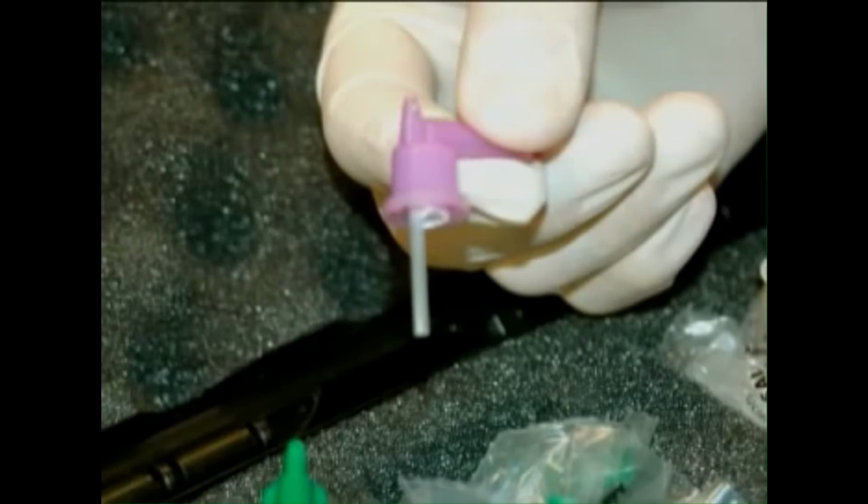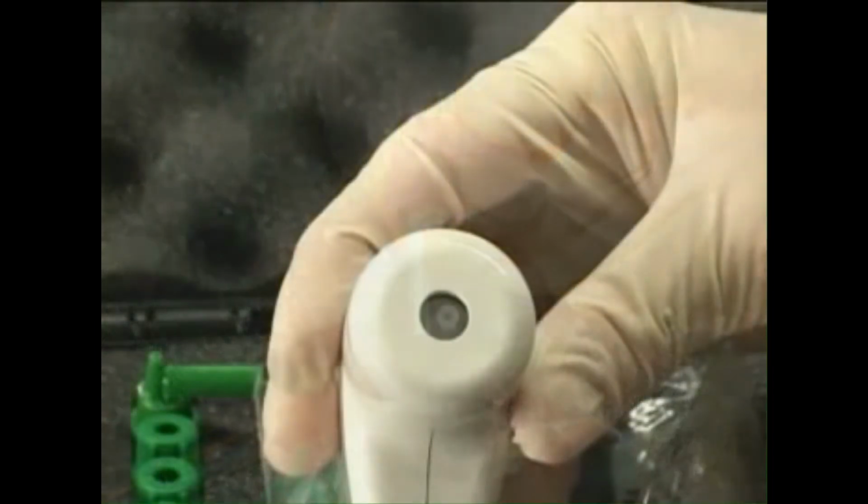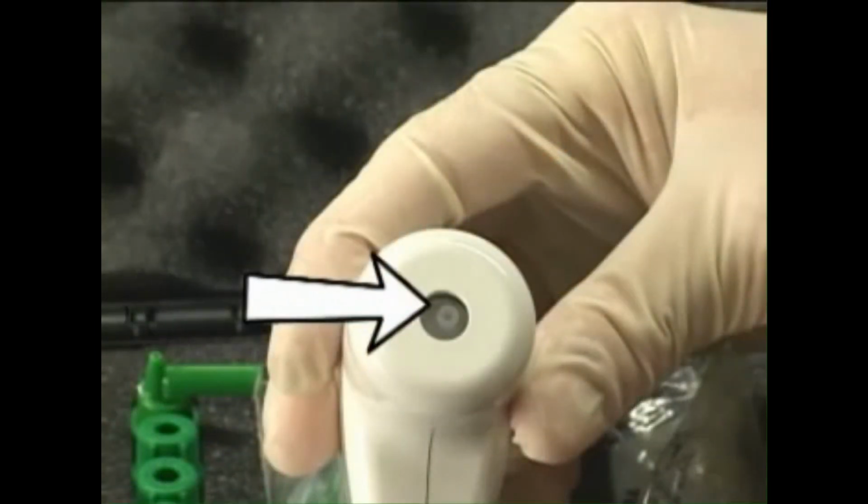The adapter contains a capillary straw that is internally coated with anticoagulant to allow the blood sample to come into immediate contact with the anticoagulant, eliminating one of the major causes of clotting. This is especially helpful with slow bleeders. The quick draw adapter also contains a primary vent filter that prevents blood and airborne particles from escaping the collection vial. A secondary hydrophobic disc filter is in place in the Inovac unit to prevent any blood from entering the unit should the primary filter fail.